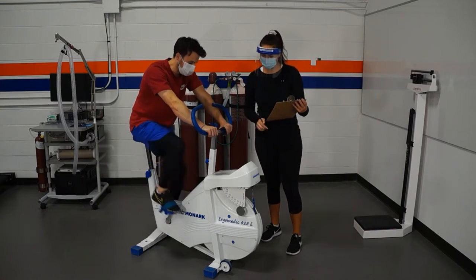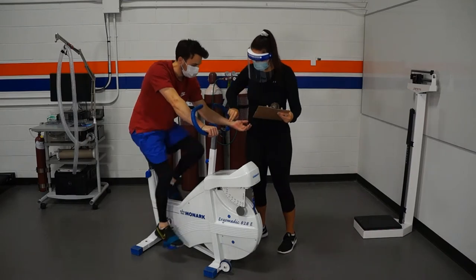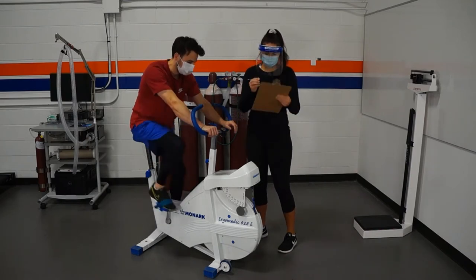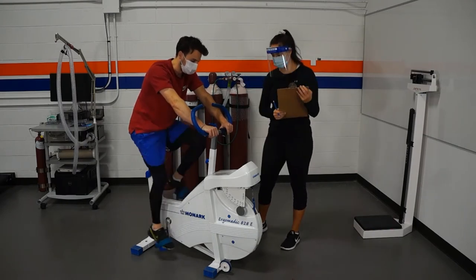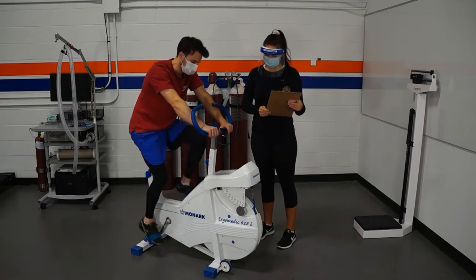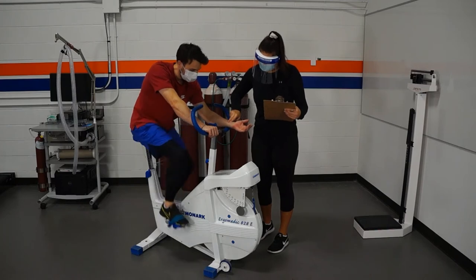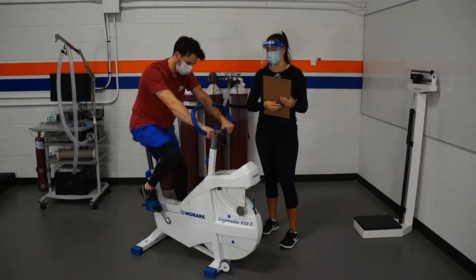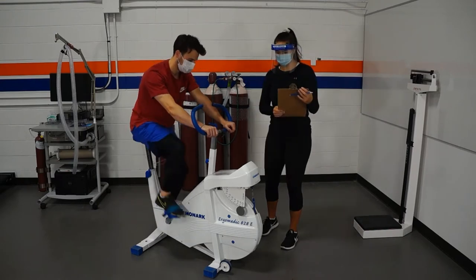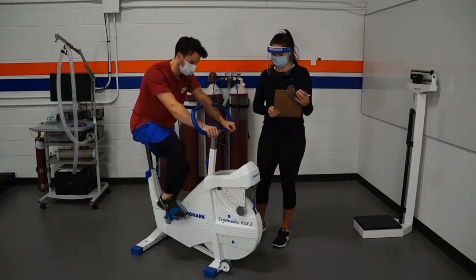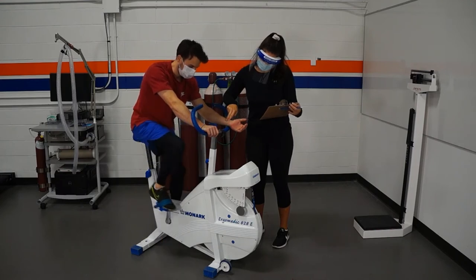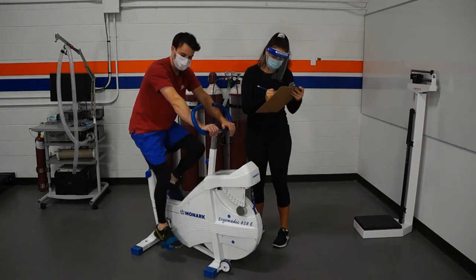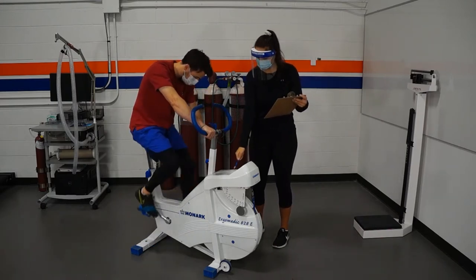Please note that for the sake of time, the middle sections of each workload have been sped up in this video. Now at the end of the third minute of the workload, you'll take the participant's heart rate, comparing it to the second minute heart rate. If it is within five beats per minute, you'll write that down and end this stage, moving on to the second stage. Don't forget to have the participant rate their perceived exertion and also write that down.